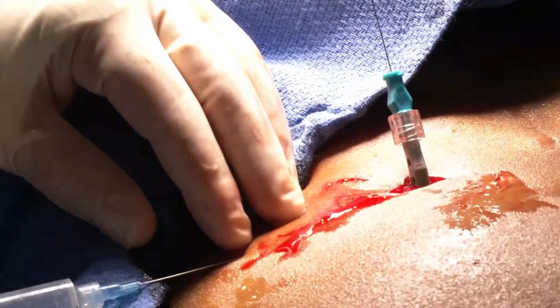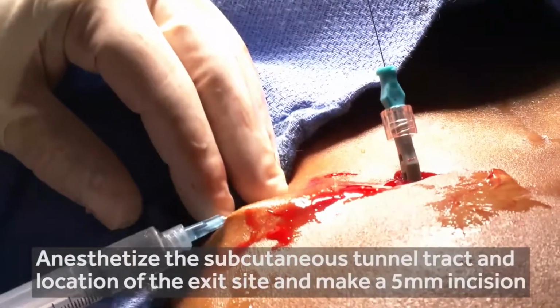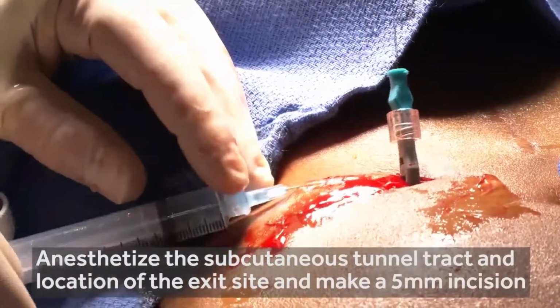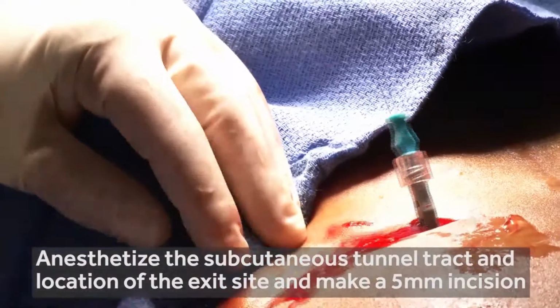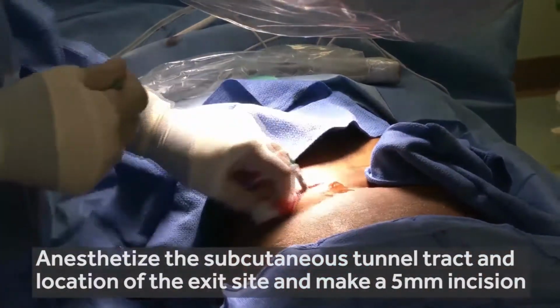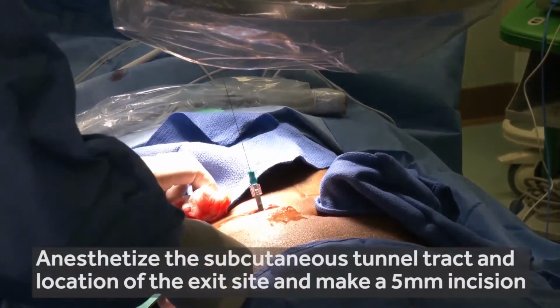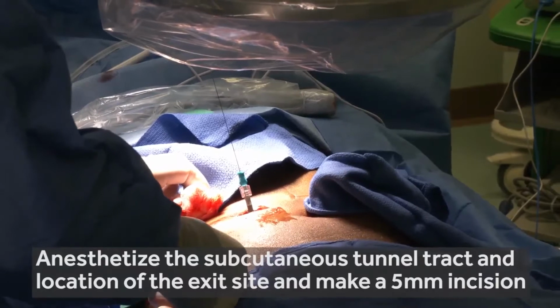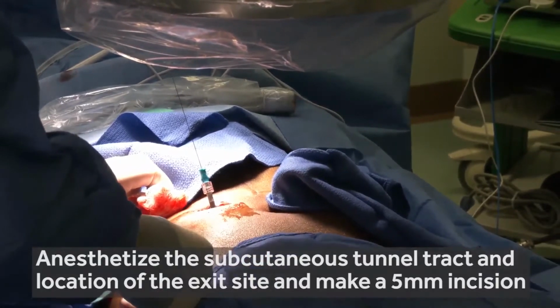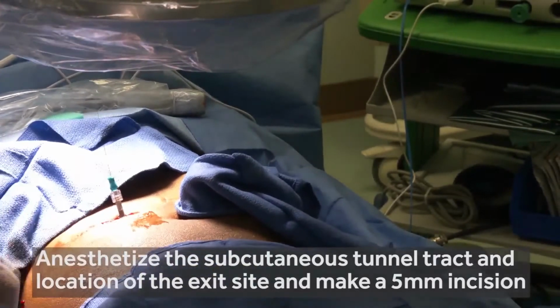And that will depend on whether you're using a catheter with a right angle, a catheter with an acute angle that will be angled down towards the hip, or if you're using a straight catheter that you may want to exit over the sternum. We use those sternal catheters for people that have a lot of panniculus, and we want to keep the catheter away from that area, and it'll exit in the area of the sternum.